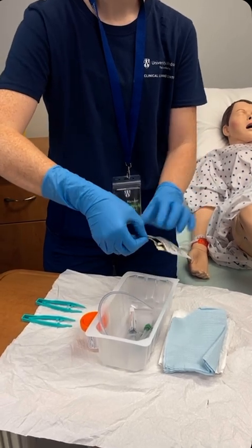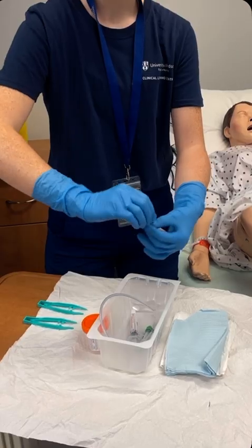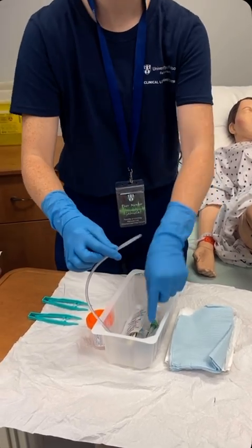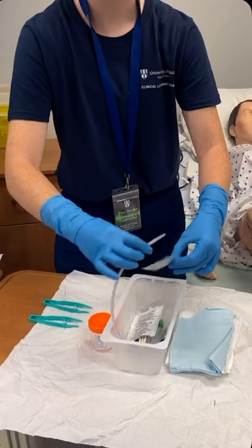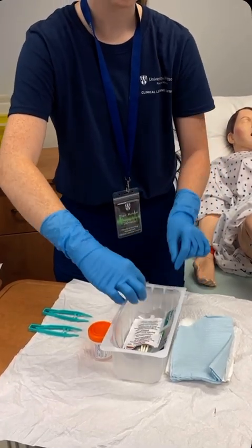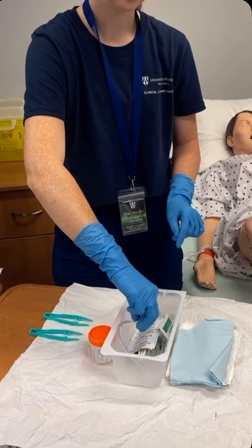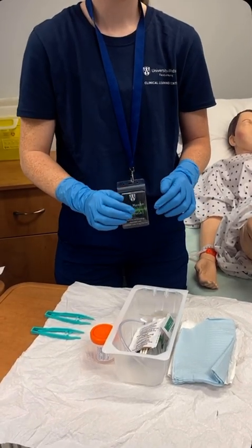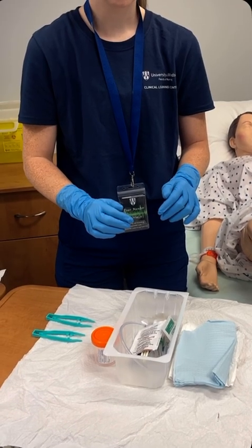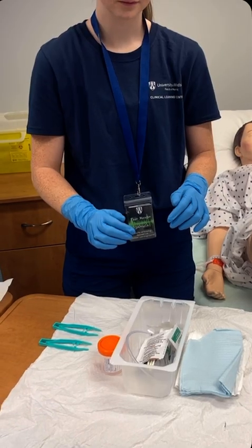Lubricate catheter 2.5 to 5 centimeters. Prepare cleansing swabs. Open the C&S container if required. For an indwelling catheter, follow the manufacturer's instructions. Manufacturers are currently not requiring testing balloons at Windsor Regional Hospital, Blue Water Health, or Chatham-Kent Health Alliance.